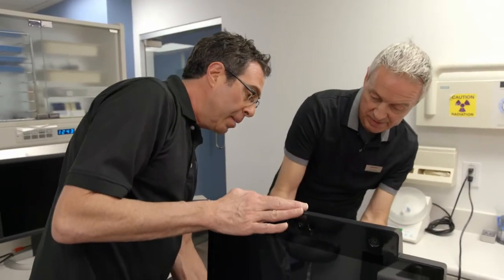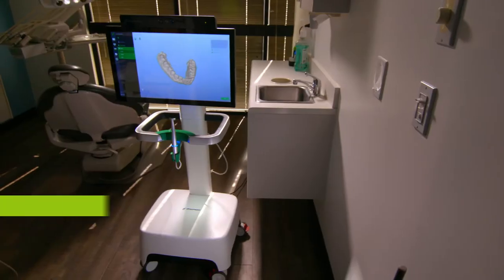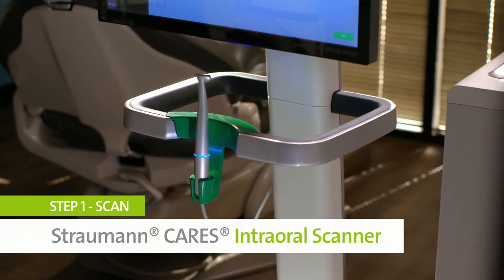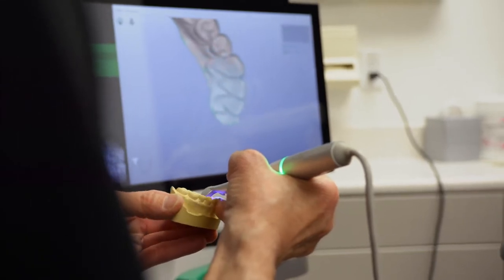So we're going to demonstrate setting it up, scanning a patient, designing a crown, and milling it in-house. It's a lot of fun learning how to do this. It's simple — it really is just plug and play, and it just works.